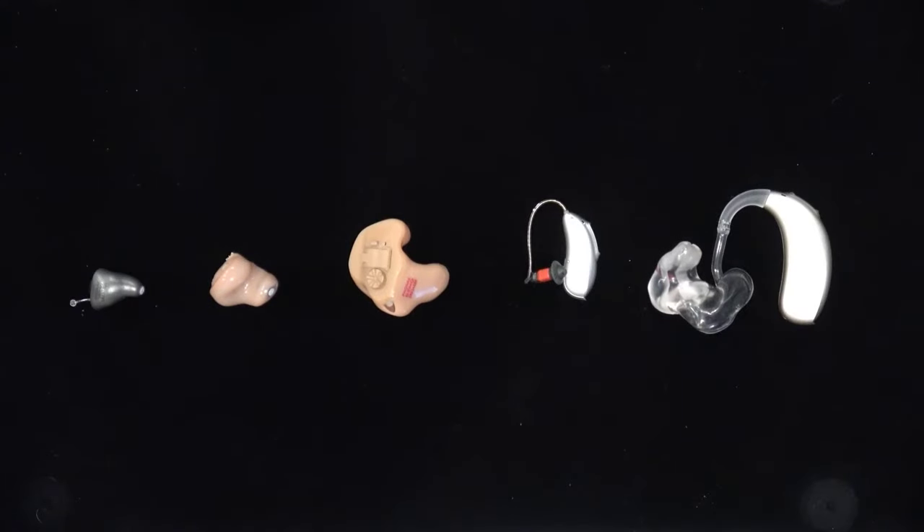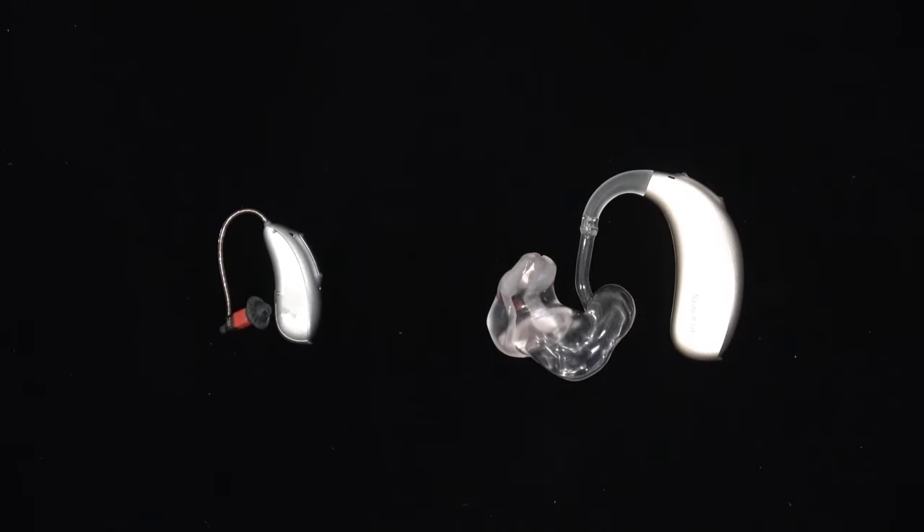Here are five different hearing aids. Three are custom in-the-ear devices and two devices are worn behind the ear. Each of these devices have microphones, but the microphone ports — or the openings where the microphones can access the sound around you — are slightly different between them all. Here we have a receiver in the canal hearing aid, otherwise known as a RIC, and here we have a behind-the-ear hearing aid, otherwise known as a BTE.